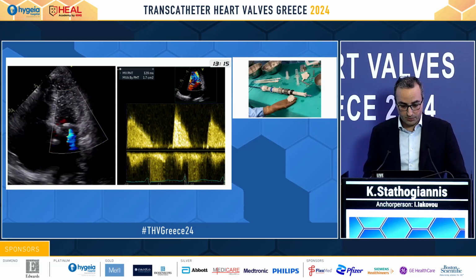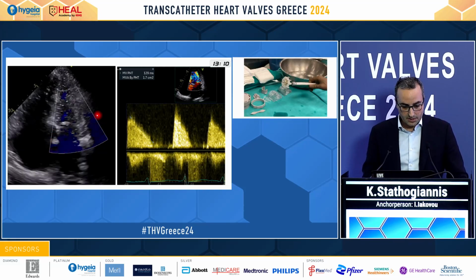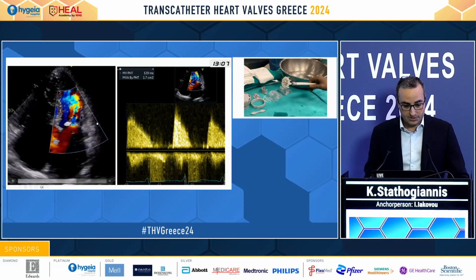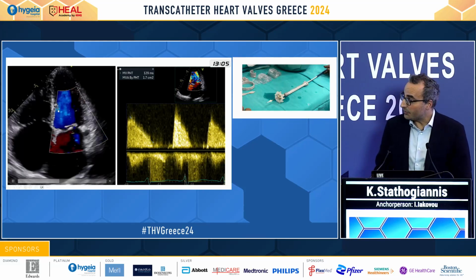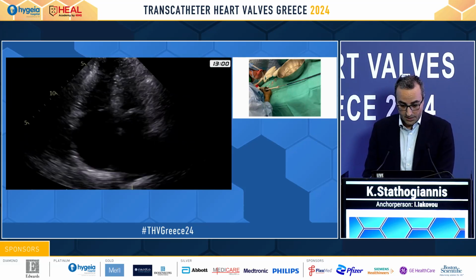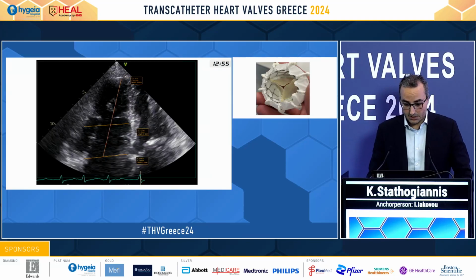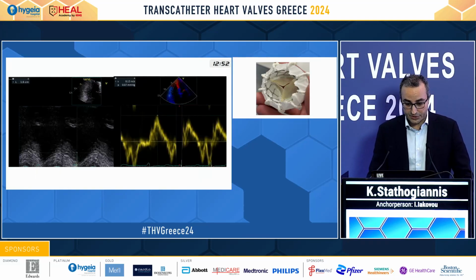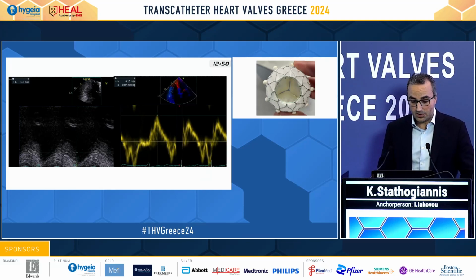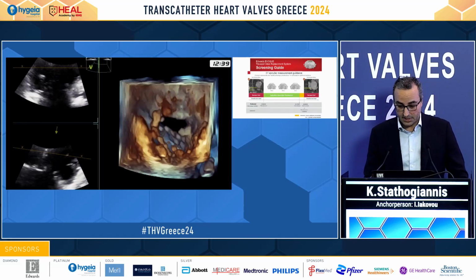Apical four-chamber view, we can appreciate the mild MR, maybe some mild to moderate mitral valve stenosis. Rather enlarged right atrium and right ventricle, and we can appreciate the sizes here as well. Enlarged right chambers. Dimensions measured. So we have been talking about who are the ideal candidates for tricuspid valve therapies. TAPSE on the left side, TDI on the right side. Seems that we have a pretty good functioning right ventricle.